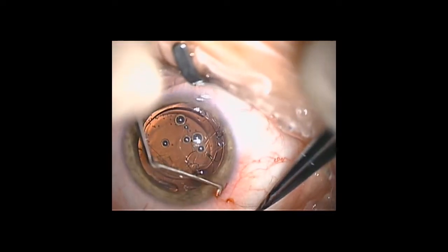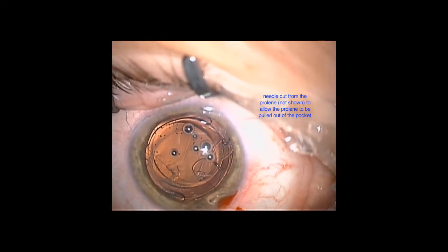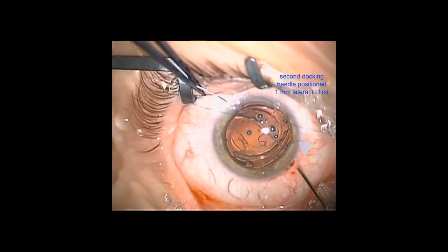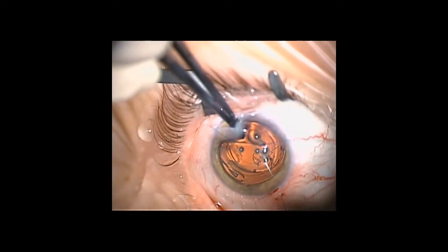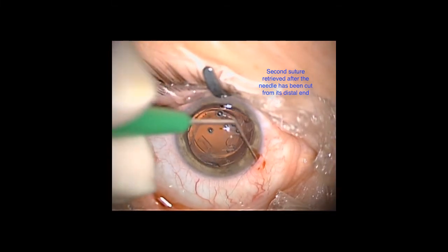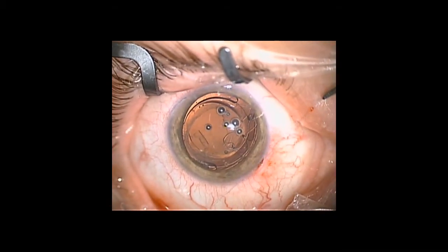The first suture is retrieved from the scleral pocket prior to introducing the second needle one millimetre lateral to the first. The second suture is then similarly retrieved. Both sutures are then tied using an initial double throw to allow the knot to slide easily and symmetrically into the scleral pocket. The suture is then tightened to the point of IOL fixation within the centre of the pupil, and locked with a further two single throws.